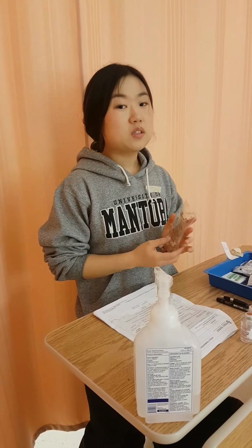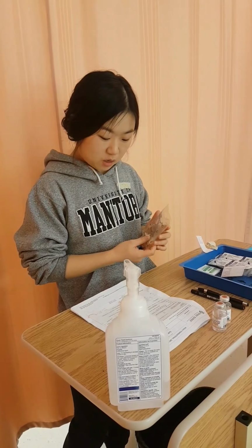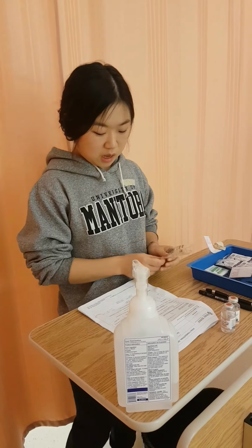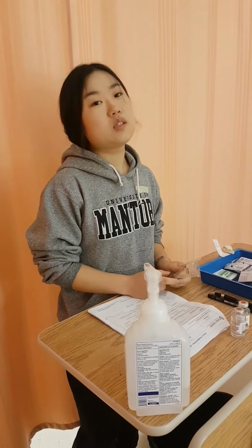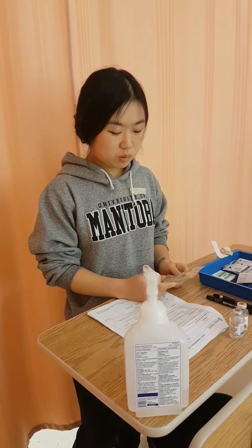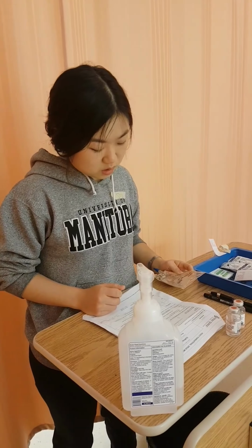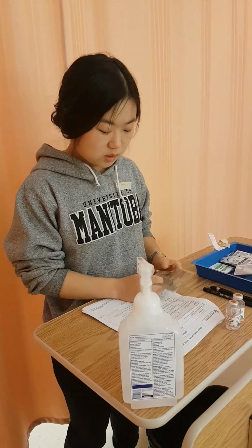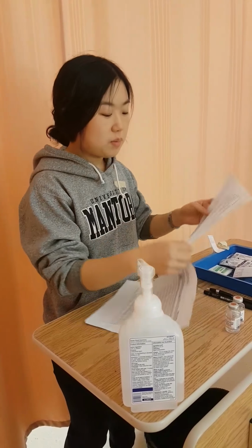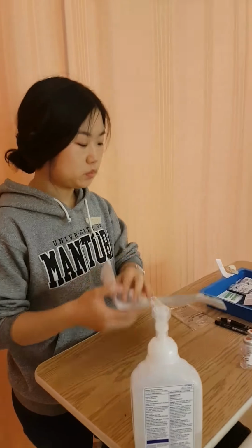50 milliliters because this patient is already receiving adequate fluid from his primary infusion, and normal saline because that's what's already being infused currently to the patient. And I'm going to administer this for 60 minutes because this patient has an appointment in 2 hours, so I want to give this med before that. And the PDM states that I could administer this for 20 to 60 minutes, so the time is appropriate. And I'm looking at the back, and I can see here that this drug is compatible with normal saline.